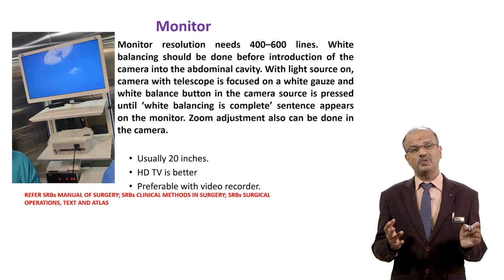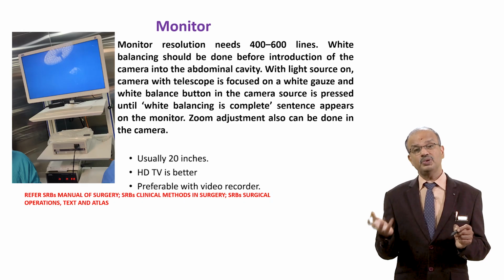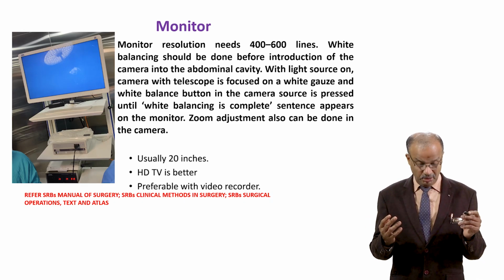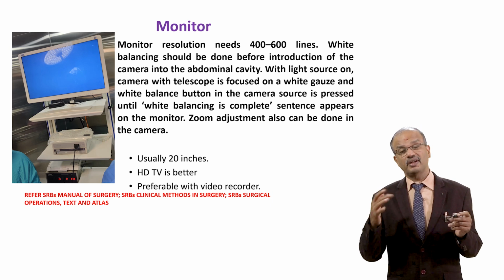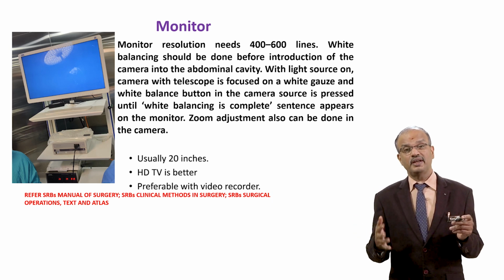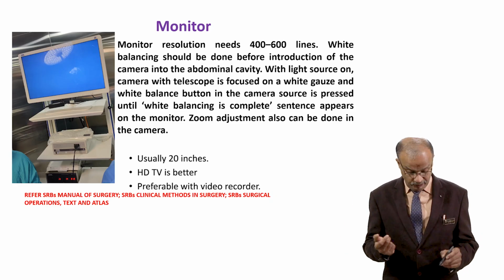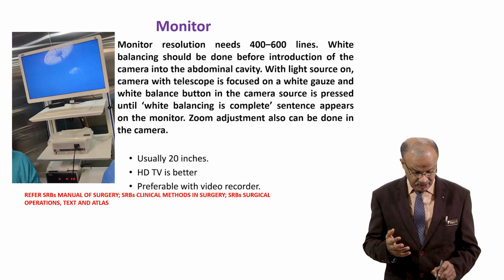Most of the time in laparoscopic surgery we record it, with a high definition camera and monitors, so that you can always go through the procedure you have done at a later period, find out any mistakes, or technically improve yourself. So recording is also very, very important.